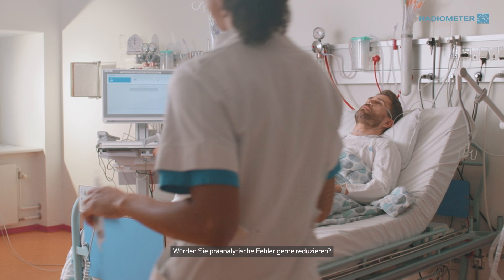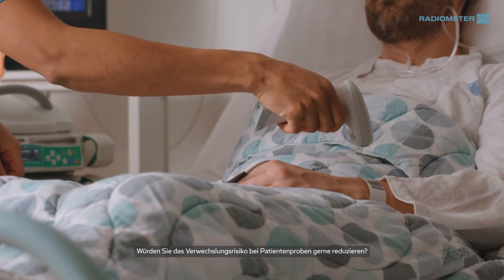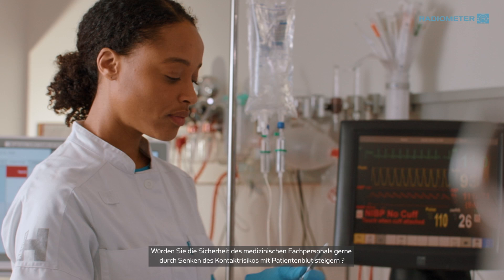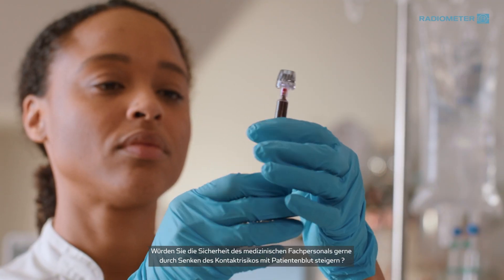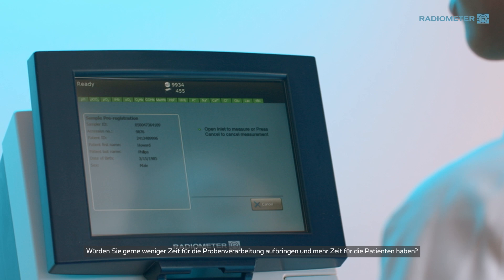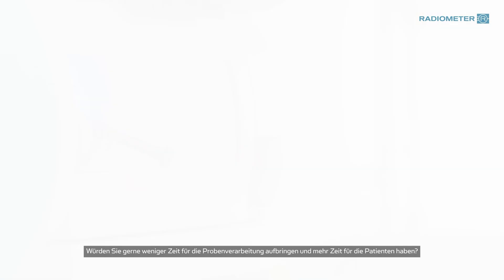What if you could reduce pre-analytical errors? What if you could reduce the risk of patient sample mix-up? What if you could increase healthcare professionals' safety by reducing the risk of contact with patient blood? What if you could spend less time on sample processing and more time on patient care?